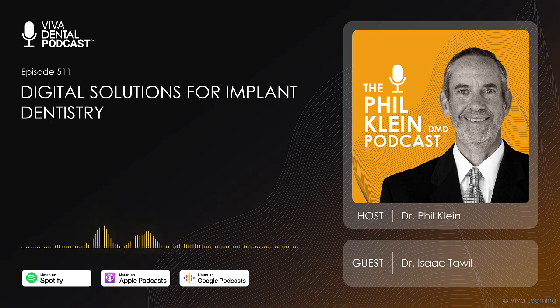One of the things that I really like to do is print 3D surgical guides so that I can perform my implant therapy for my patients under a controlled environment. Sometimes my cases are under sedation and the patient may move around. It's nice to have control using a surgical guide where we can get, if not perfect, then as close to a perfect position of where our original plan was to put those implants.